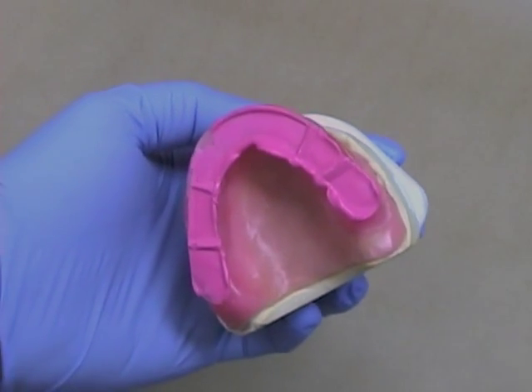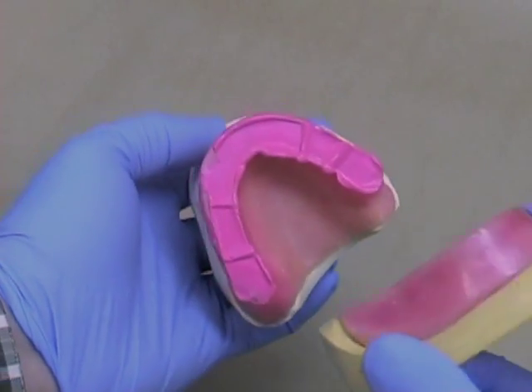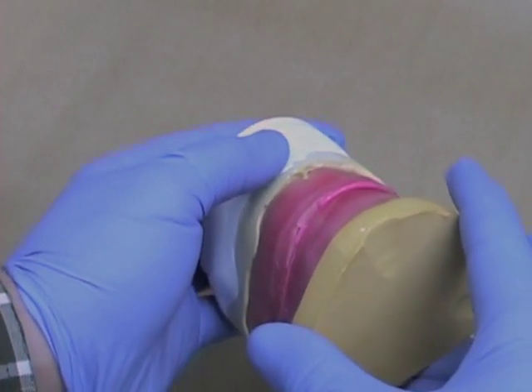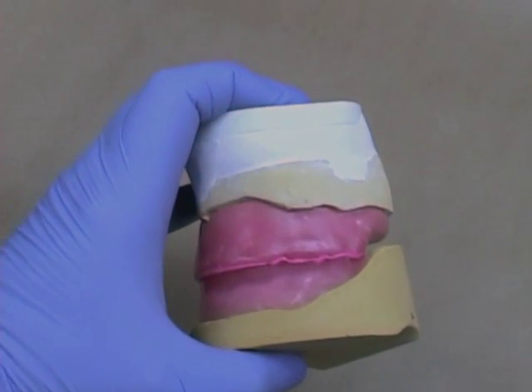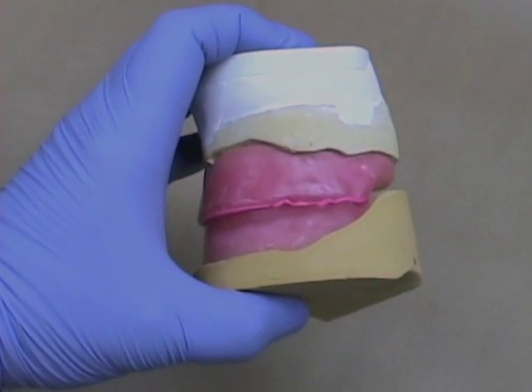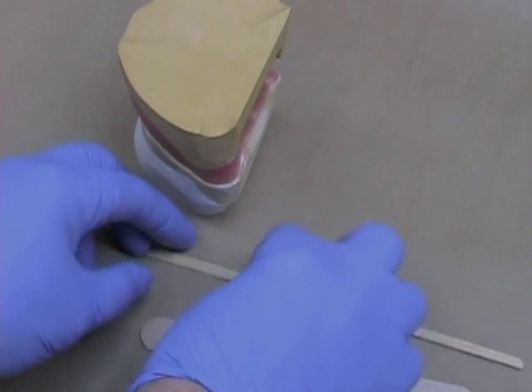Before mounting the mandibular cast, interdigitate the maxillary and mandibular wax rims in the centric record to make sure you have no interferences in the posterior regions, either between the record base and the casts or the record bases and themselves.